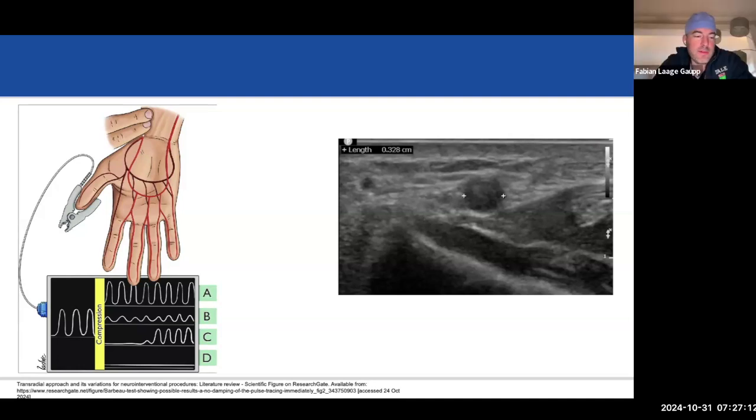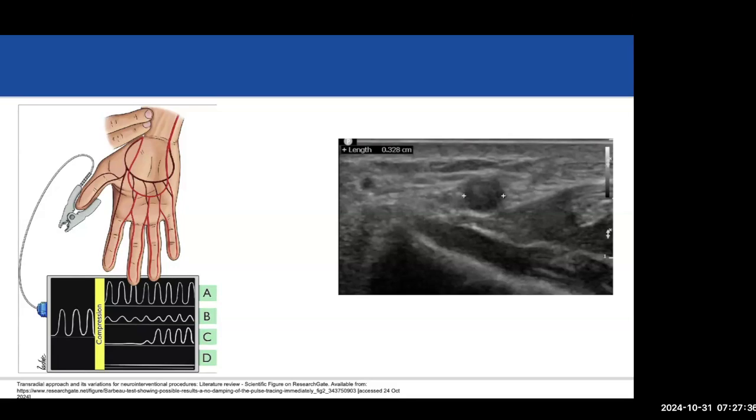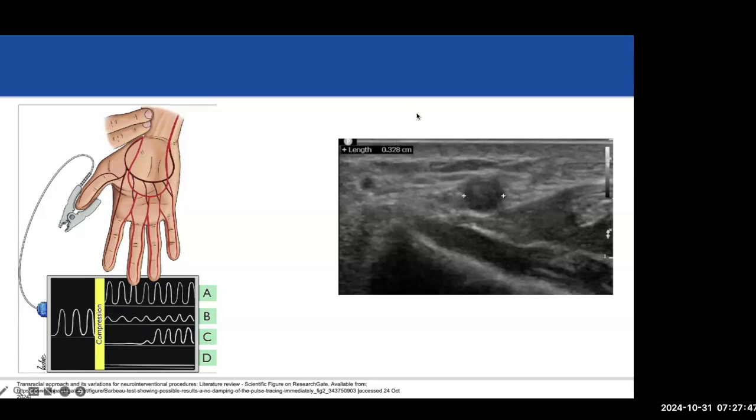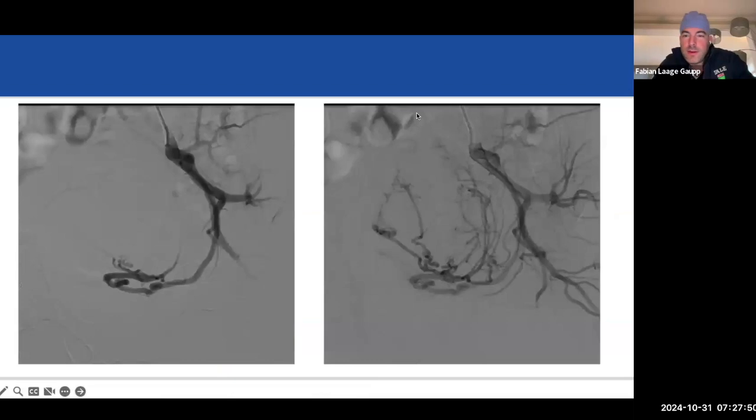The verapamil, the calcium channel blocker, is very painful when you inject it. So usually when we do that, I have my sheath in, I draw up the cocktail in a 10 cc syringe, but the volume of the cocktail is only around 4.5 cc. So I hook it up, fill it up with blood to dilute it, and then I very slowly inject it. And then you really want to make sure that your sheath is connected to a sidearm drip, right? You want to have a continuous drip going through there.